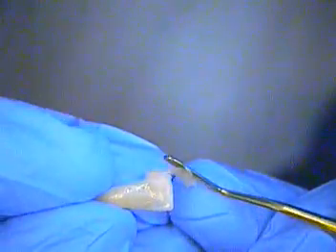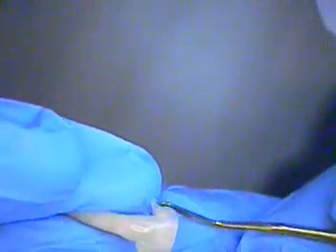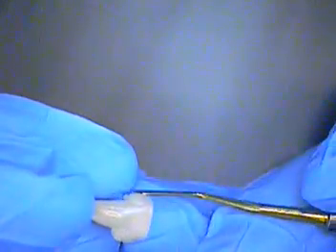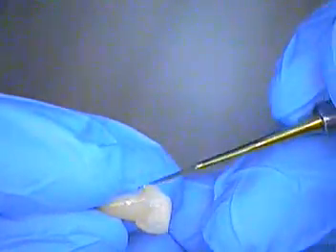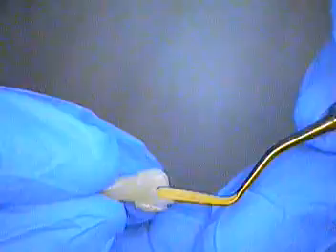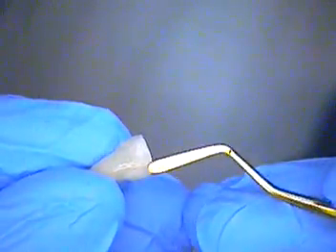I'm going to make sure this is the right color. We're adding the material — this is just to tack it into position. Now, we may use an opaque type of bonding composite because we don't want light to travel too easily and get a gray area in between the teeth, so we might go on the back of that with an OA2. Right now it's an A2, but an OA2 might be what's in order.